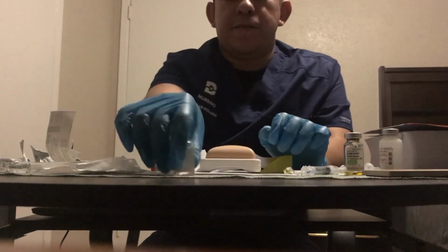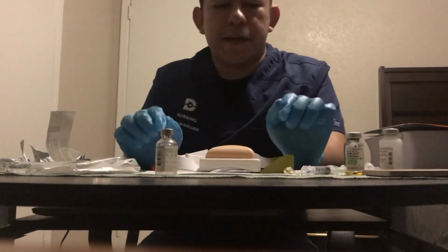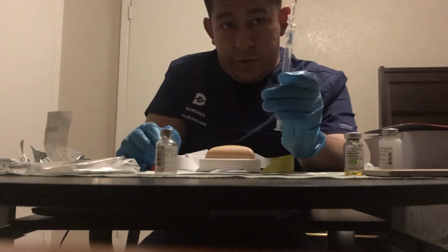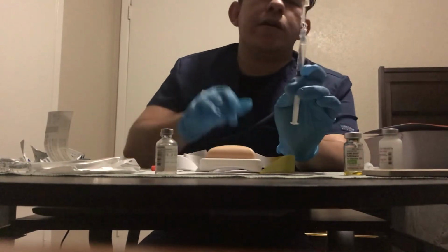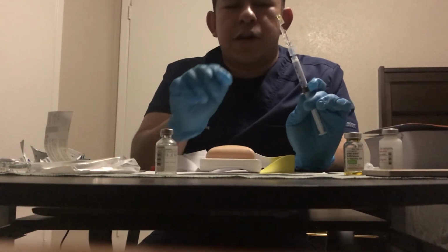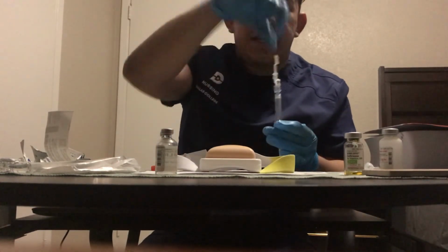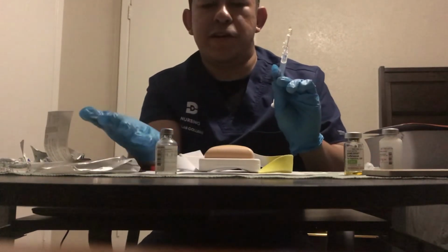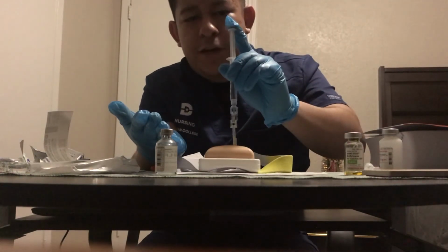So for the Z-track method, once again, after we get our alcohol pad and wipe the injection site, what you're going to do is have your syringe of ceftriaxone, and like I said in the medication room, you're going to put on a fresh new needle for your patient. So once you have that fresh new needle on, you take the cap off, and then you're going to pull with your hand away, and then you're going to inject at a 90-degree angle slowly.